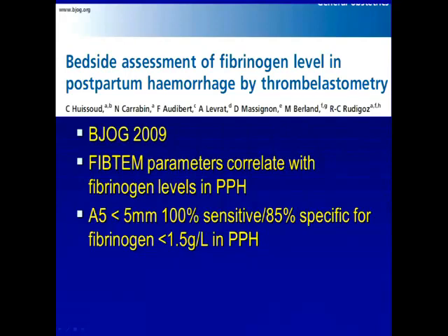I've been working with Aaron Sloan on that, so it's just a matter of going through. A lot of things have been held up by Fraser Health, because if you think about it, this is the first new intra-operative point of care test we've had in a while. And think of all the issues we have with blood gas machines, which have been standard care for decades, and they periodically come up and are quite aggressive with our perfusionists about having them on site. It's been a major challenge, so getting the lab on board took time. We started talking about this three years ago, with a similar talk to what you gave, an excellent talk.